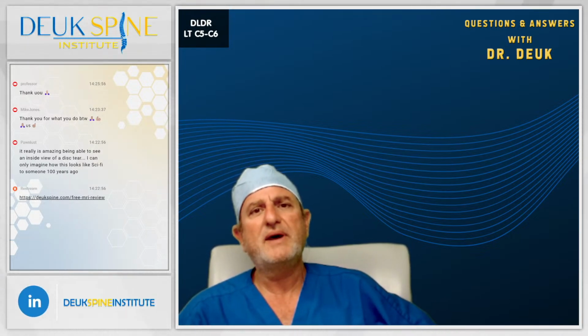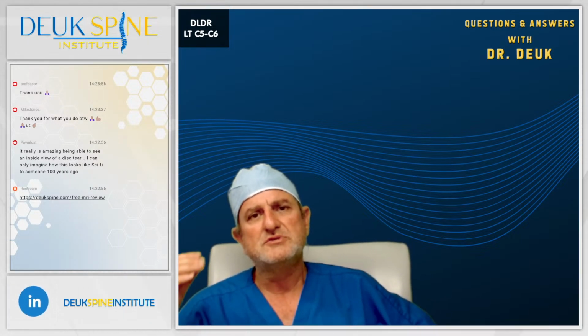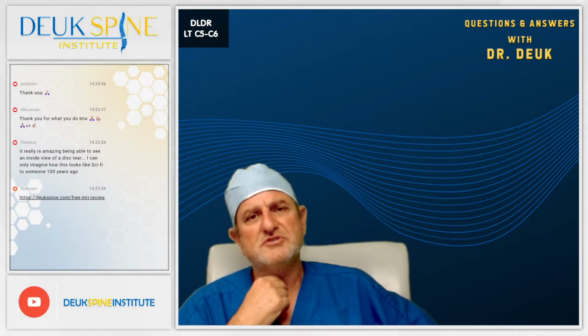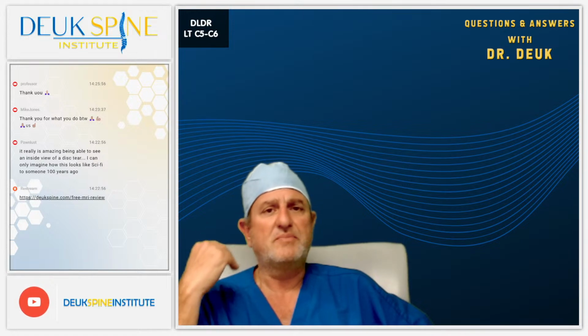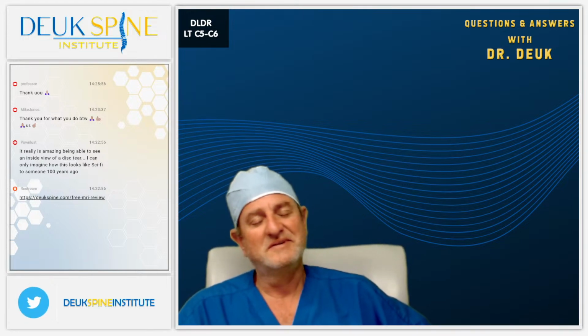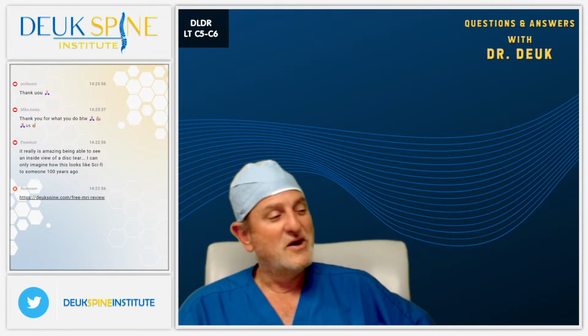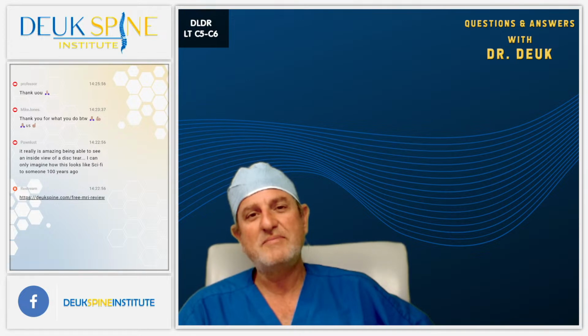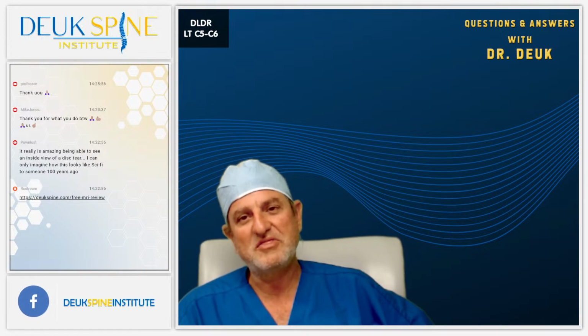It really depends on the patient. Some spines are more superficial. They're close to the front, the skin. Some spines are really deep. Trust me, I hate the deep spines, but I don't turn patients away because they have a deep spine and a thick neck.